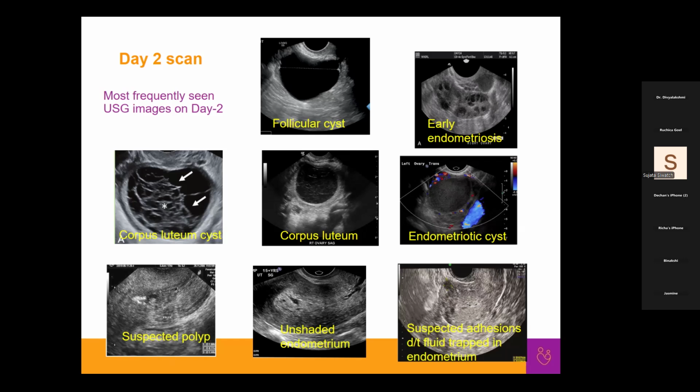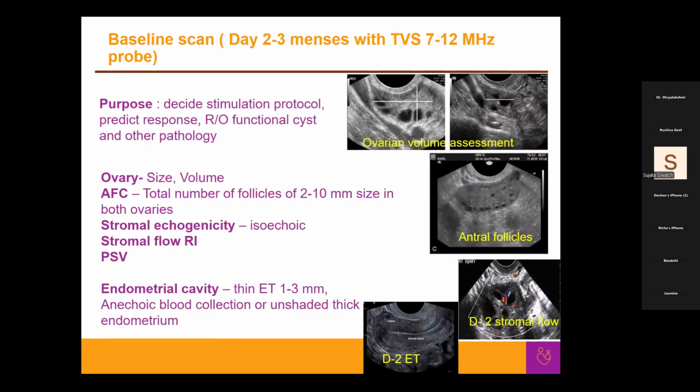And one comment you made was that you should be doing the monitoring yourself. Yes, ma'am. That may not be possible for everybody, so what do you suggest? For centers that don't have their own ultrasound machine, it is not very easy. But ideally, the person who is doing the IUI should have an ultrasound machine also, because it is a highly important factor.